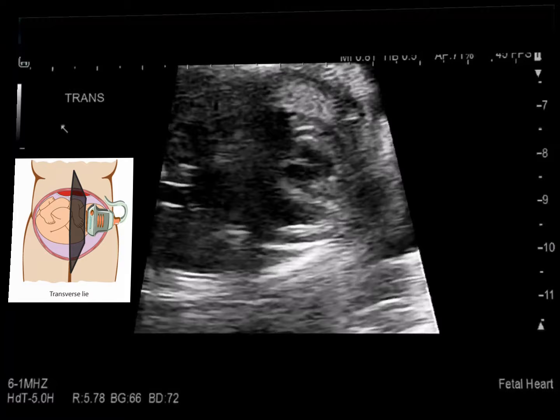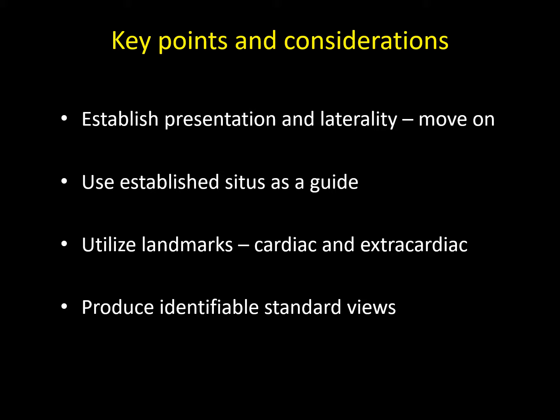Very important points and considerations during your scan: establish the presentation and laterality in the fetus and then continue your scan. You've already established where the fetus is lying within the maternal abdomen and where the cardiac structure lies within the fetal chest. Use that established situs as a guide for your scan. When looking for left or right sided structures — cardiac or extracardiac — you have that situs as a guide. Landmarks both inside and outside the heart, like the trachea and the stomach, are perfect for establishing the situs and sidedness of structures within the fetus.